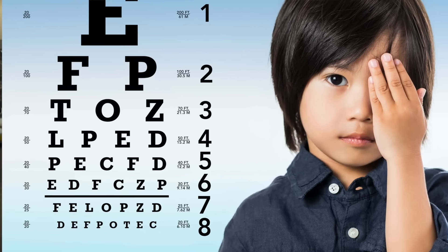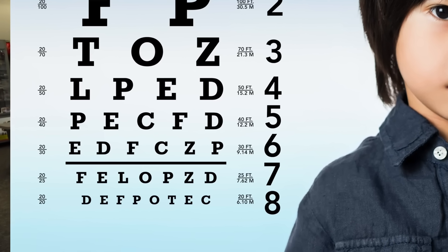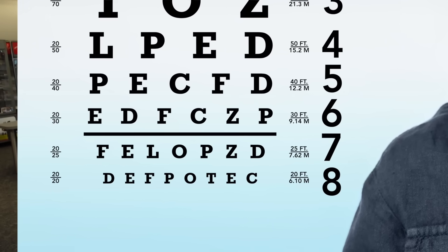How much should you expect your vision to improve with ortho-K lenses? Two key benchmarks optometrists look for are whether you can see the 20/20 line and whether you can see well enough to drive. Studies show that 95% of people wearing ortho-K lenses will see well enough to drive, and about 75% of people will achieve 20/20 vision without glasses or contact lenses after wearing ortho-K.